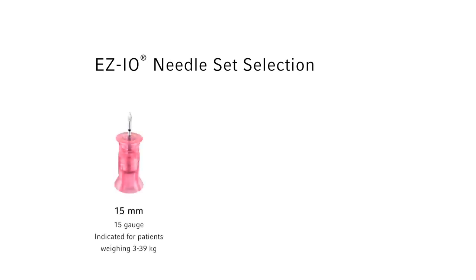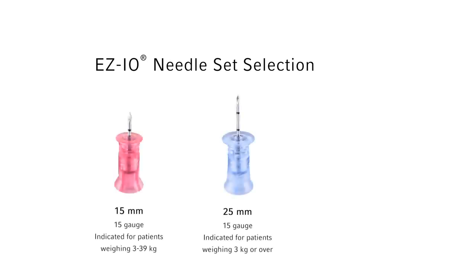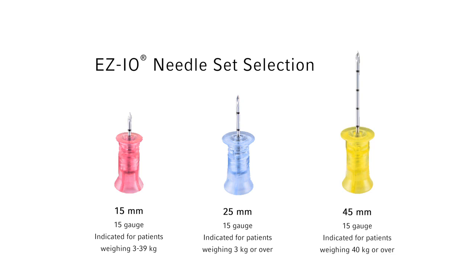Critical judgment should be used to determine appropriate needle set selection based on patient weight, anatomy, and tissue depth overlying the insertion site. To facilitate selection of the correct length needle set, tissue depth over the insertion site should be assessed prior to selection of the needle set.